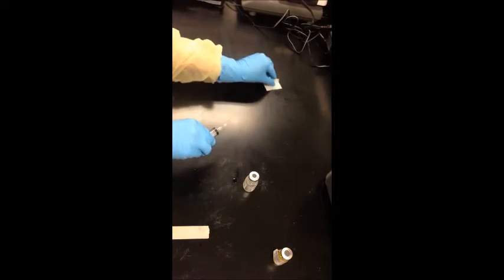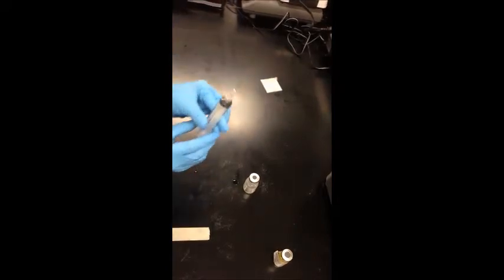Draw desired amount of air into syringe and inject into the medication vial as explained previously.